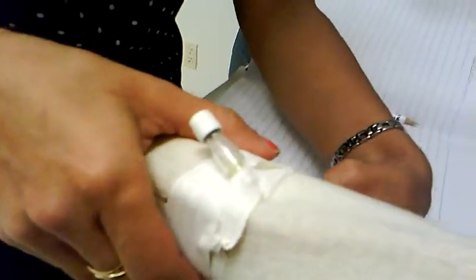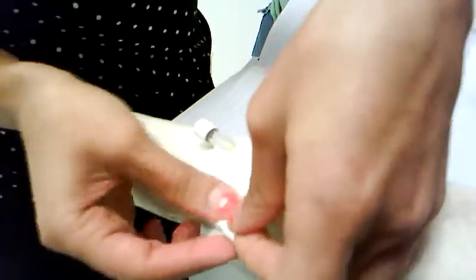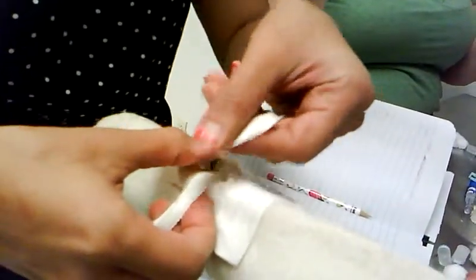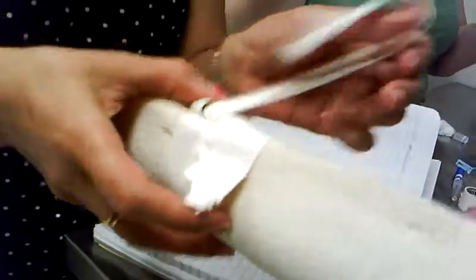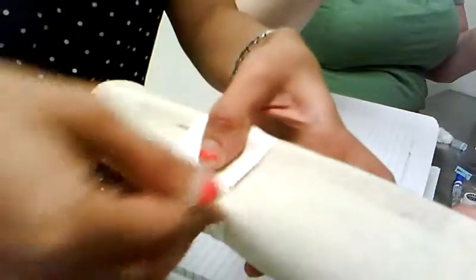Remember to fold the little end. There you go. And then you put it on. Okay, and then the last tape goes. Grab your new cap and you go cross. And then cross, and then all the way to the arm. And then just go through.